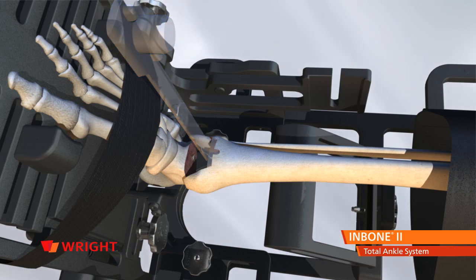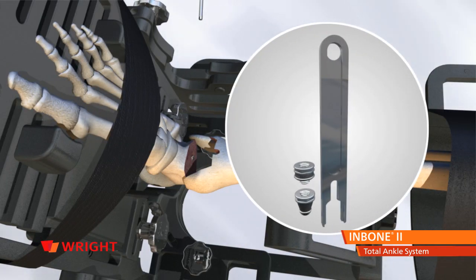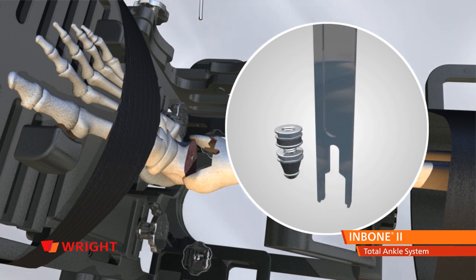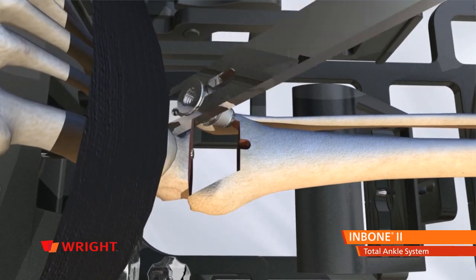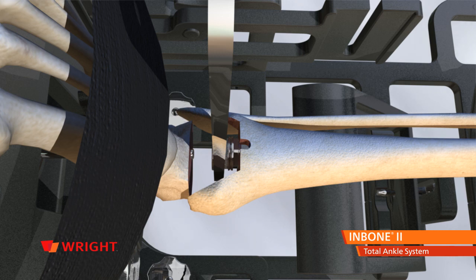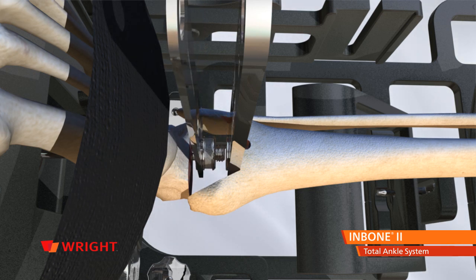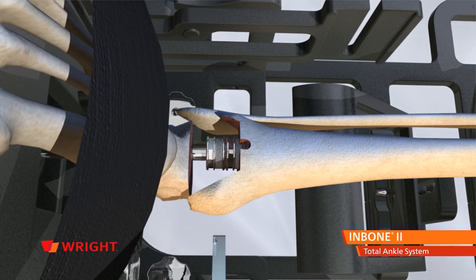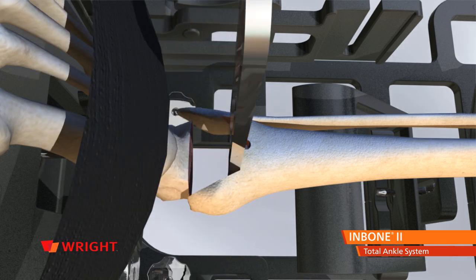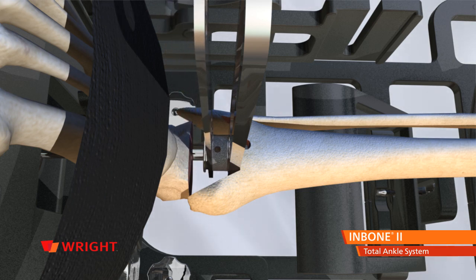The strike rod can be used to fully seat the tibial tray sizer into the tibial resection. Remove the strike rod and replace it with the X drive. Select the correct top tibial stem and corresponding wrench with the wrench oriented in the distal direction. Slide the stem pieces into the wrench with a finger or thumb to hold them in place. Introduce the stem piece into the joint space and place the nose into the intramedullary canal of the tibia. An assistant should hold the wrench while the surgeon installs the next stem piece. Insert a mid stem piece onto the clip and align the mid stem with the top stem piece. While an assistant holds the wrench, engage the X drive. Thread the stems and firmly torque them together. Remove the clip from the mid stem piece and replace it with the wrench from the top stem piece before pushing the stem up into the tibia. Repeat for additional mid stem components.